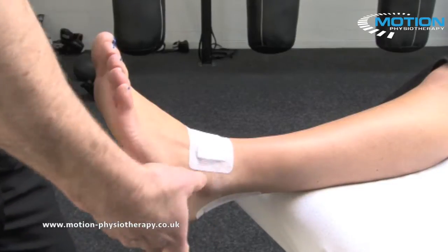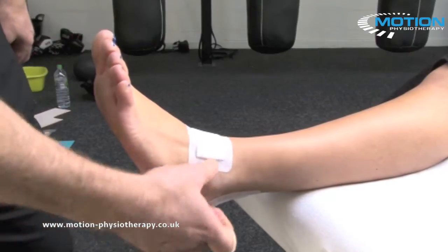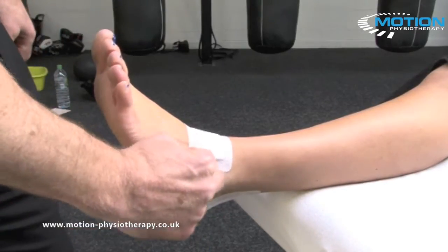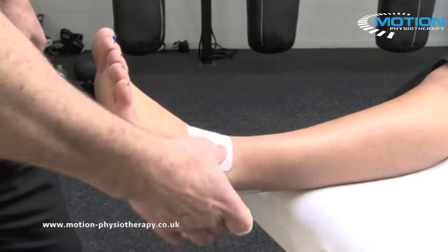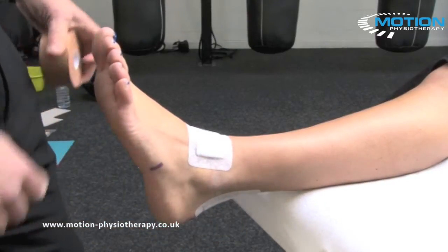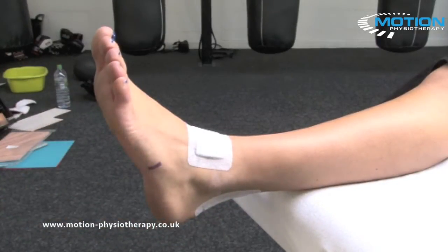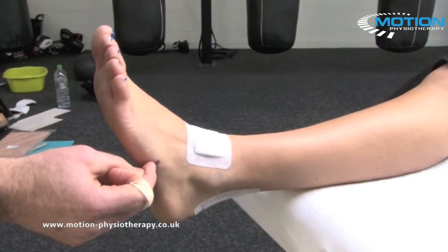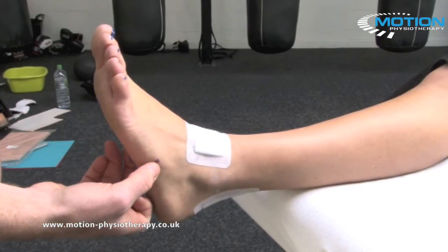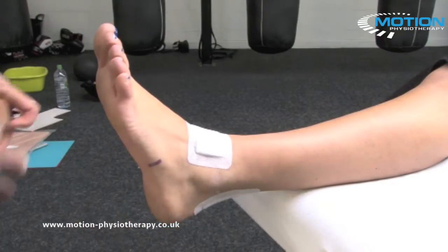The techniques we're looking at today are to help reinforce the lateral edge of the ankle. Injuries to the ATFL, PTFL, and CFL are all going to be supported by these techniques. The areas we need to be careful of are the retinaculum at the front of the ankle, so we've got a pad on there. At the base of the fifth metatarsal on the outside, you don't want too much pressure there, and not too much pressure across the Achilles at the back, so we've put a pad on there.